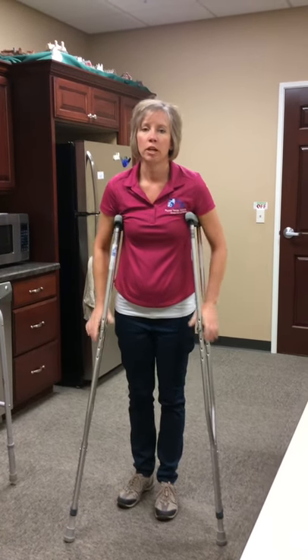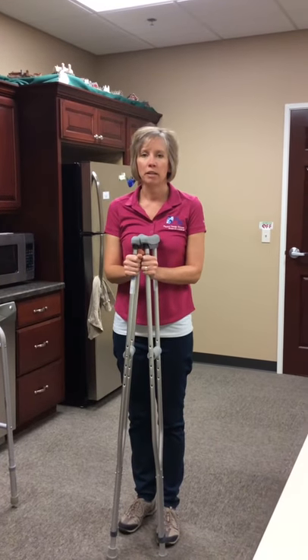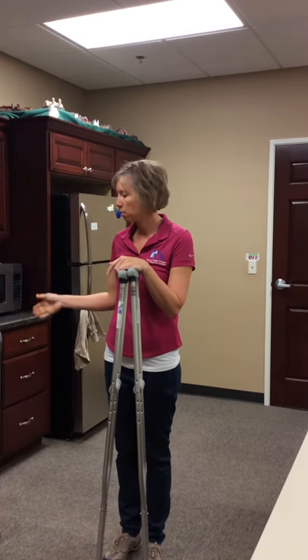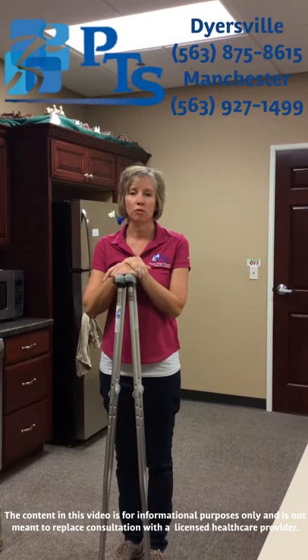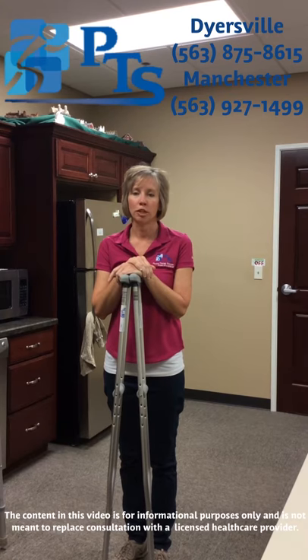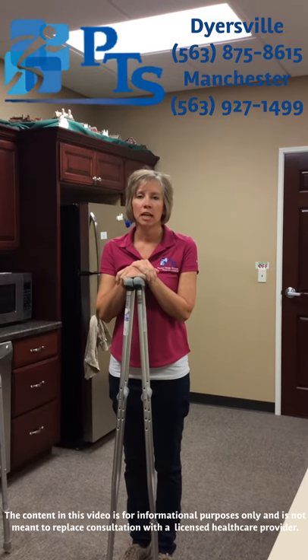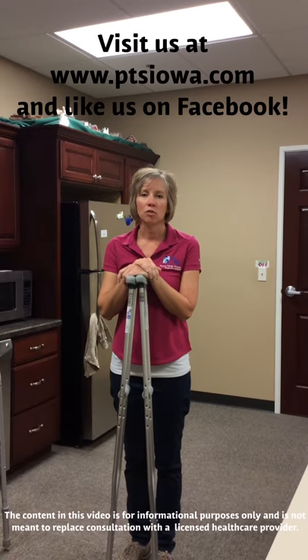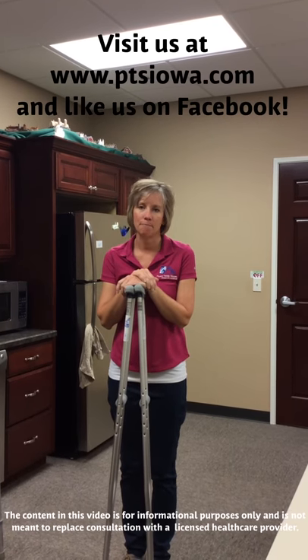Just a few quick pointers for the crutches to help you get the best fit. Depending on the circumstance, it might be a crutch, a walker, or a cane. If you ever need help deciding which would be best for you, we're always available for any questions. Please feel free to call or stop by our Manchester or Dyersville office, and you can also find us on the web at www.PTSIowa.com.